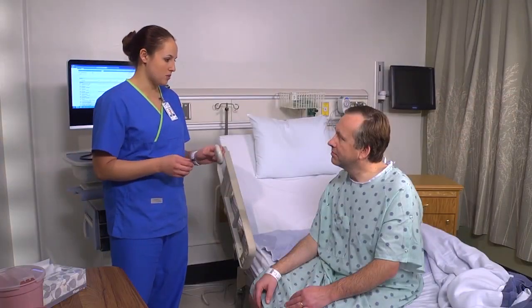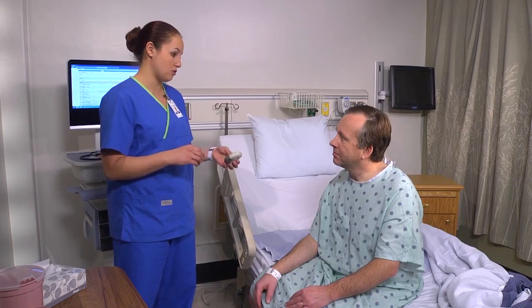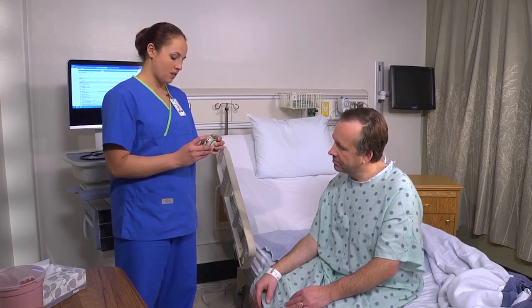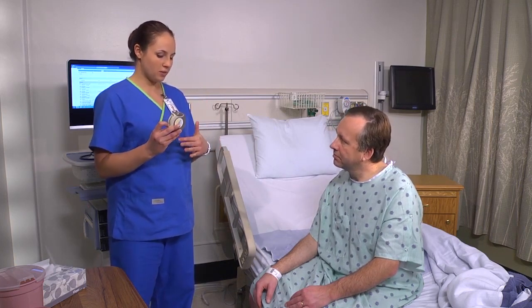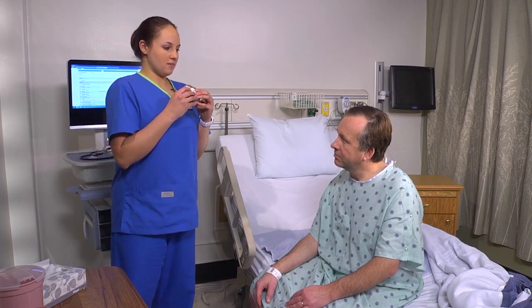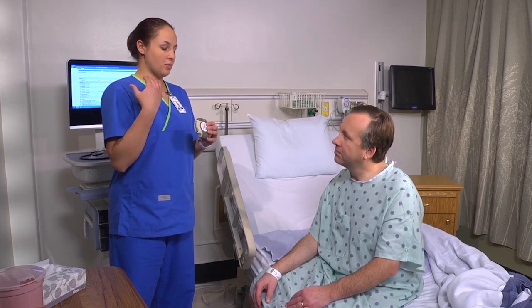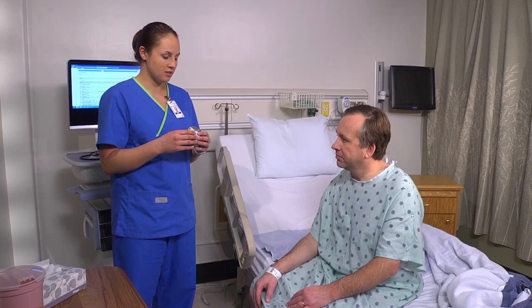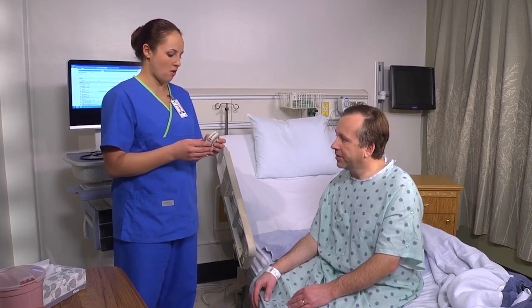Okay, we're going to practice with this trainer. Okay, I'm going to show you how to do it first, and then I'm going to have you demonstrate for me. I'm going to open it like we did before. Load the dose. Breathe all the way out. So, breathe in. Hold for 10 seconds, mouth closed. And then you're going to breathe out through pursed lips. So, okay, so breathe in, hold for 10 seconds, out through pursed lips. Okay?